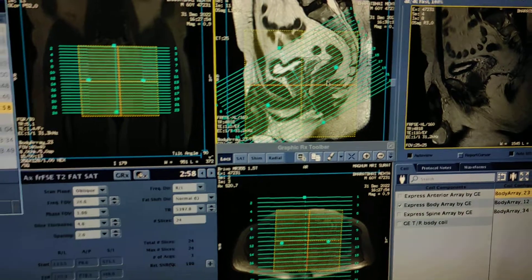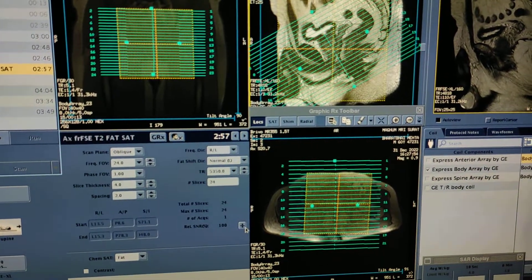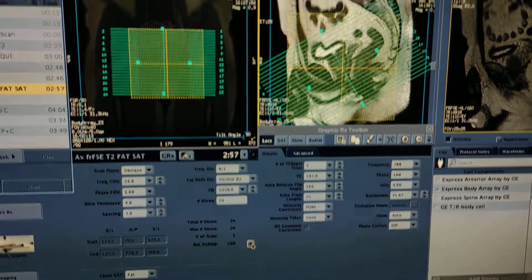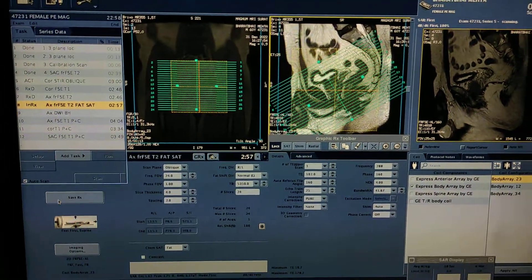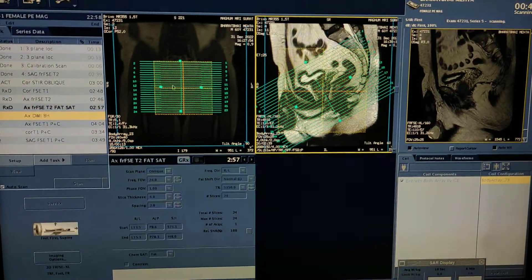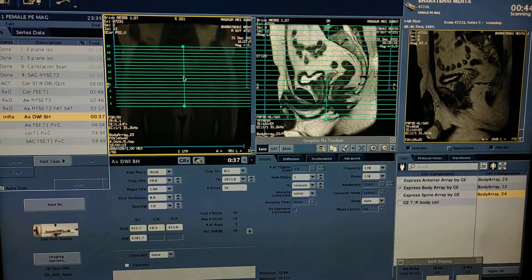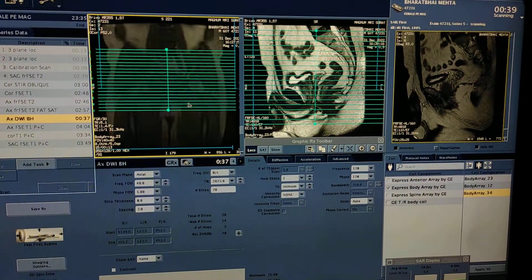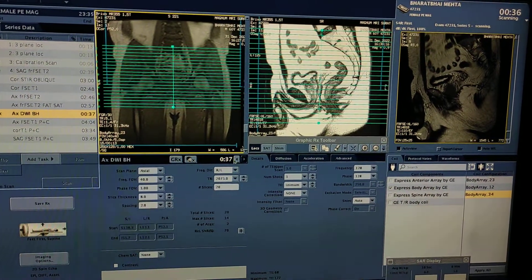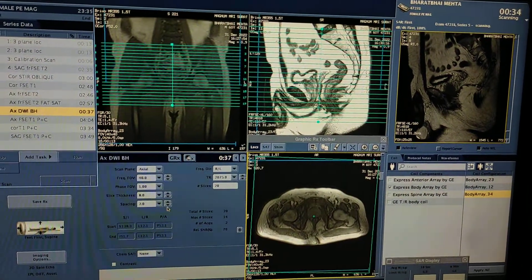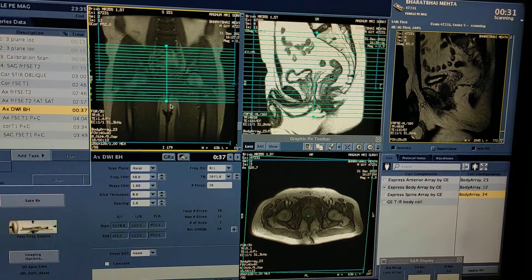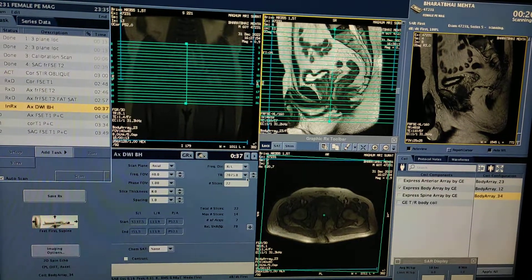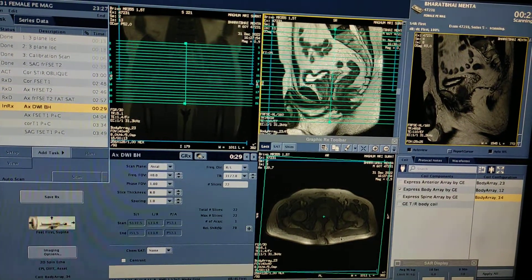Simply copy from axial T2, select axial — the same plan has been copied. Adjust the timing. For axial diffusion, I will take it for the full pelvis, not only for the prostate. This is the plan for whole pelvis axial DWI, because diffusion is very less time consuming.